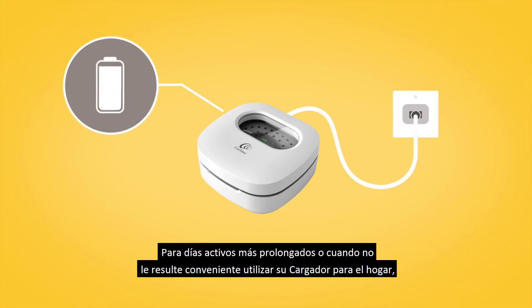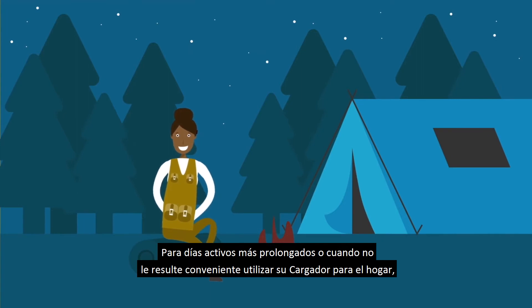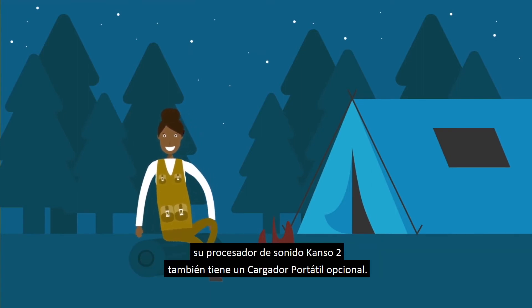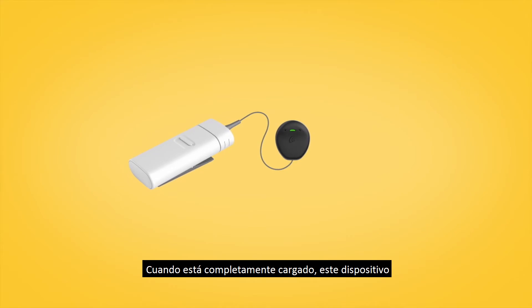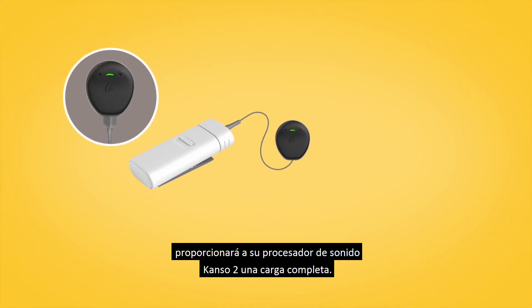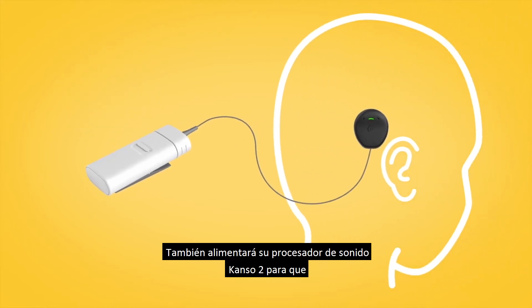For longer active days, or when it isn't convenient for you to use your home charger, your Kanzo 2 Sound Processor also has an optional portable charger. When fully charged, this device will provide your Kanzo 2 Sound Processor with one full charge. It will also power your Kanzo 2 Sound Processor so that you can still hear while it is charging.